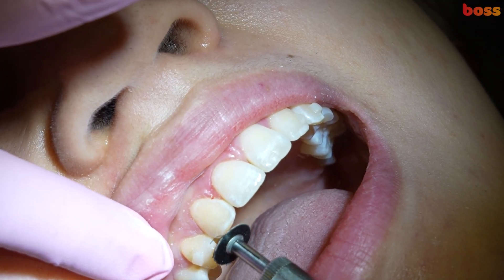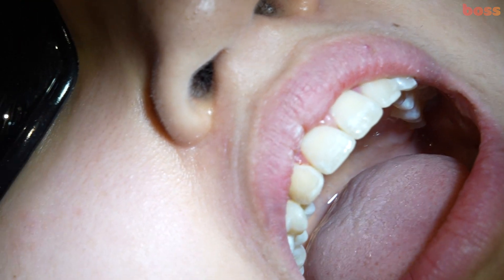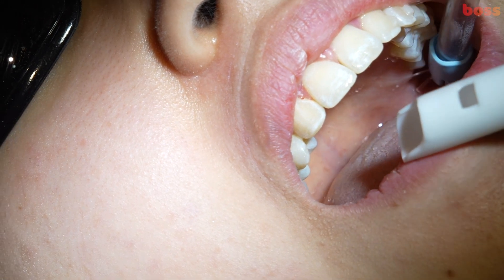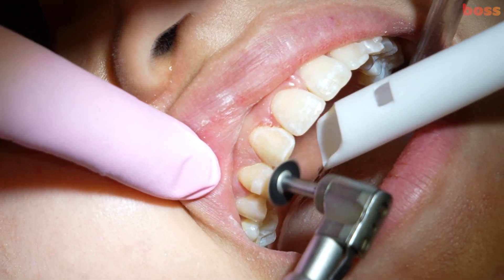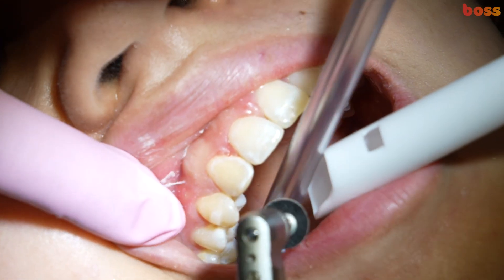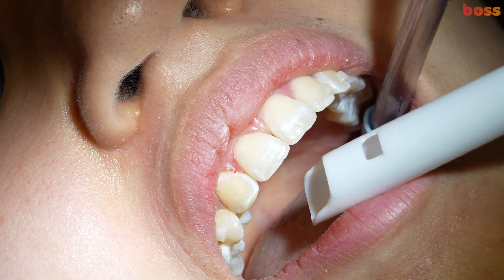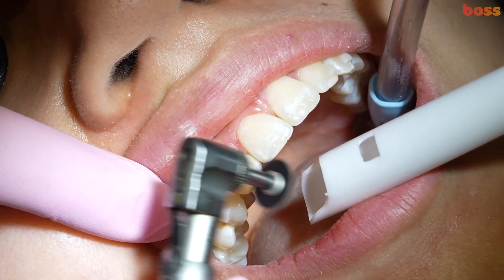Now I'm going to use a soft flex disc to do the finer polishing, and we can use the same disc to refine the height of the contour as well.